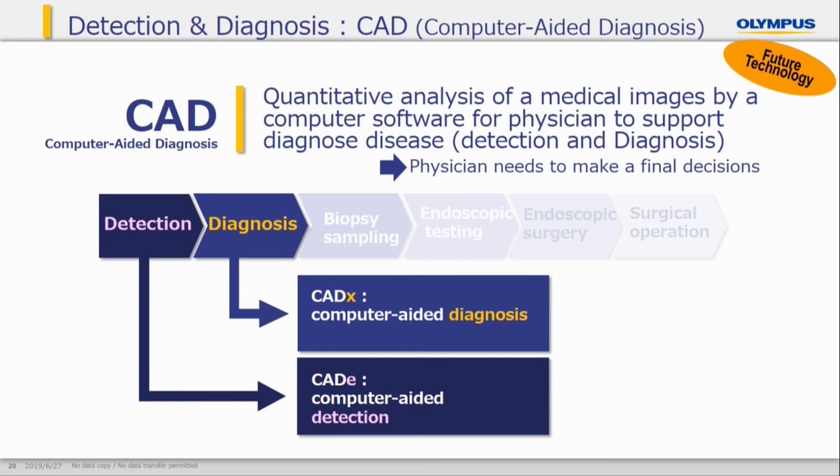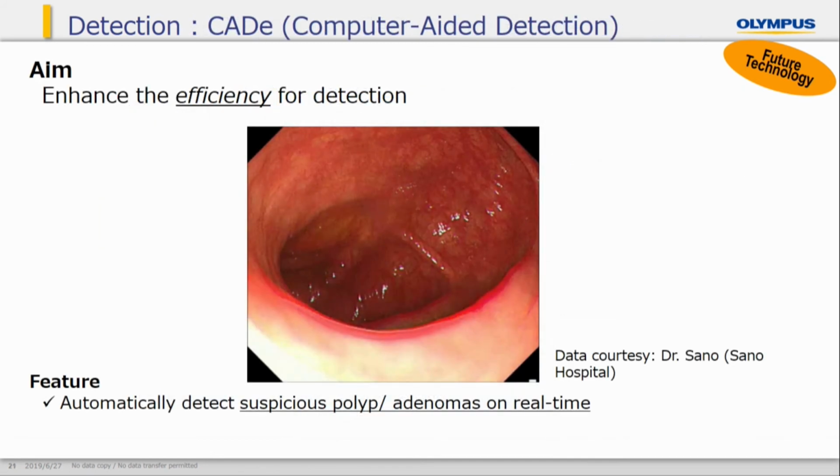For detection, it is named CADe, Computer-Aided Detection. And for diagnosis, it is named CADx, Computer-Aided Diagnosis. Let me briefly introduce these functions.